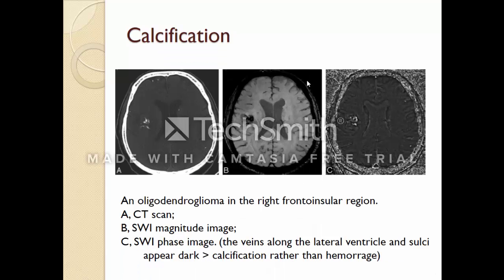So calcification is a very important indicator in the diagnosis and the differential diagnosis of brain tumors, because in the MR images, brain tumor can be observed either due to the hemorrhage or due to the calcification. So it depends on the susceptibility difference of this tissue. Although hemorrhage can be observed by the iron deposition, which is a paramagnetic material, the calcification is observed due to calcium phosphate, which is a diamagnetic material. Both will cause local magnetic field changes, and that results in phase changes as well.